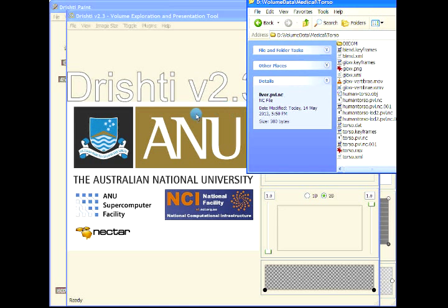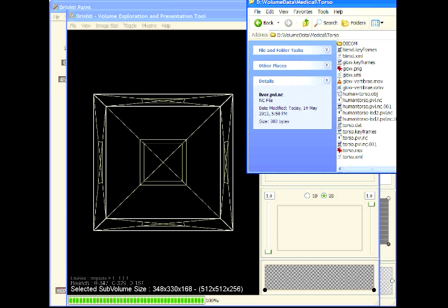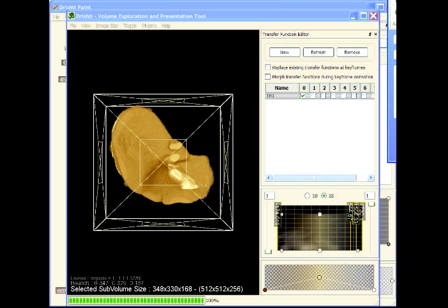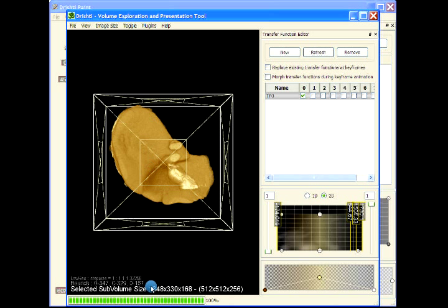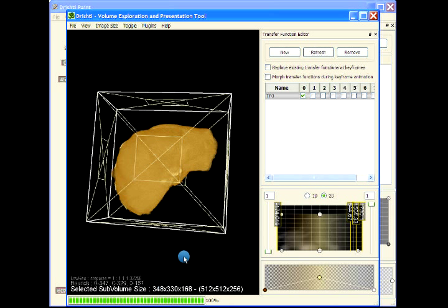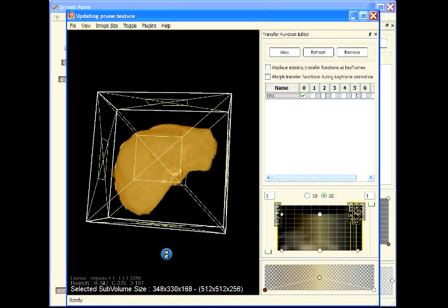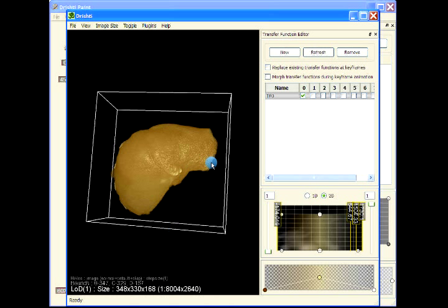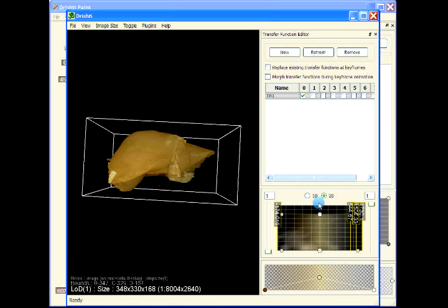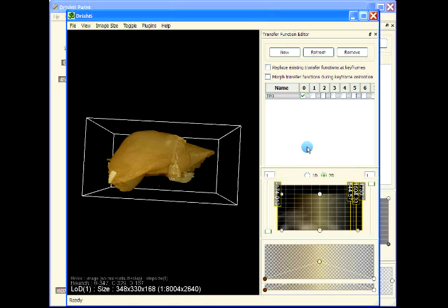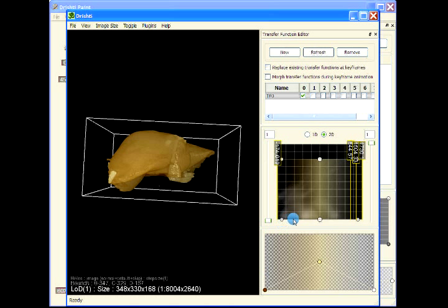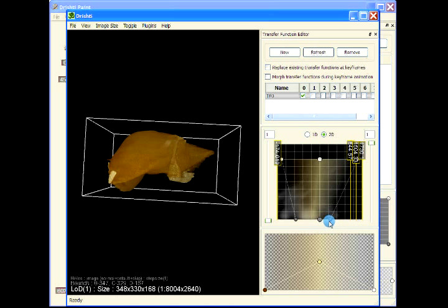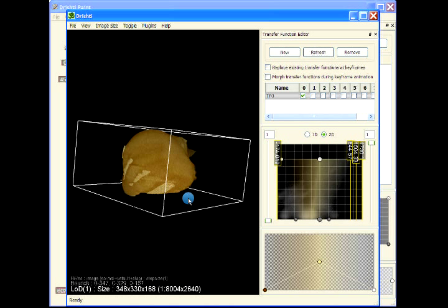Here it is. Here is the liver, and we can just modify our transfer function so that we see only the liver.